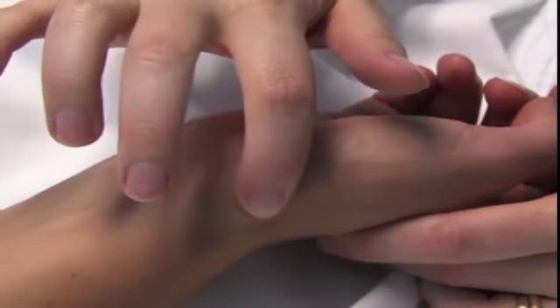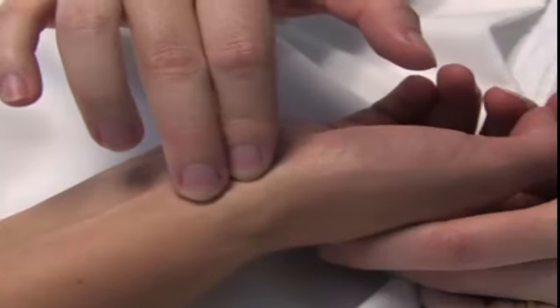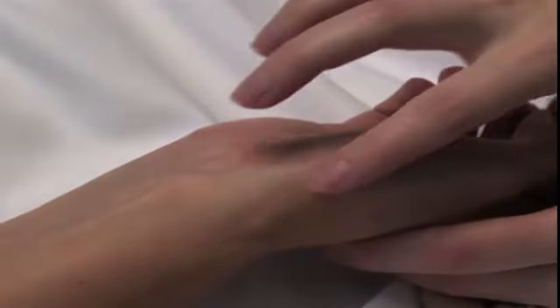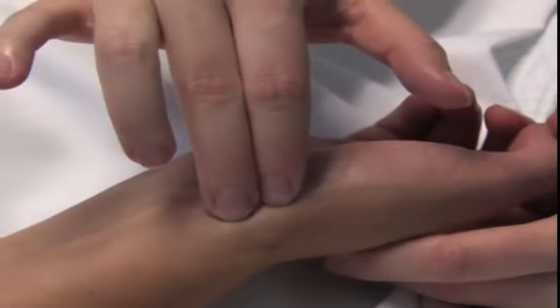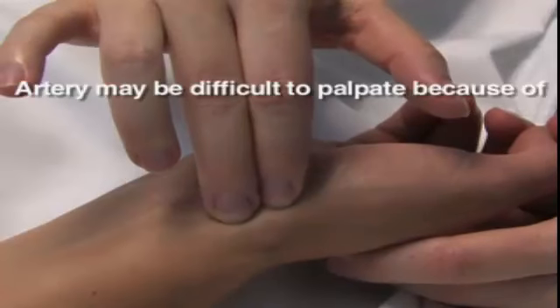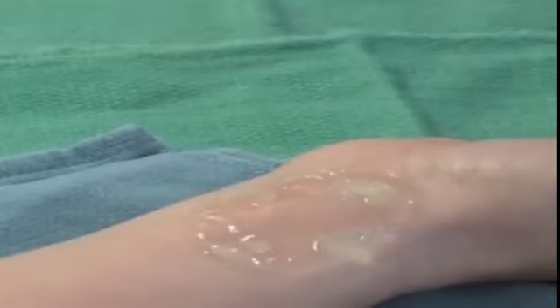First, palpate the styloid process of the radius. Next, palpate the flexor carpi radialis tendon located medial to the styloid process of the radius. Now locate the artery between these 2 points. The artery may be difficult to palpate, for example, in the presence of overlying edema or vasospasm. A portable Doppler ultrasound device may be used to identify the location of the radial artery in these instances.